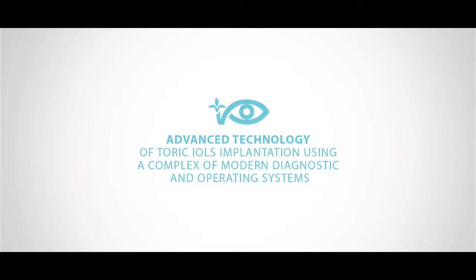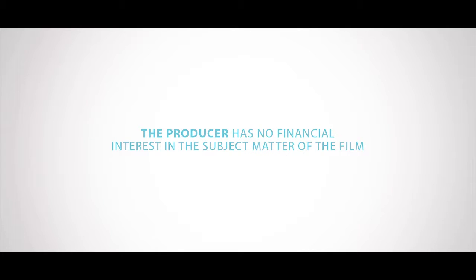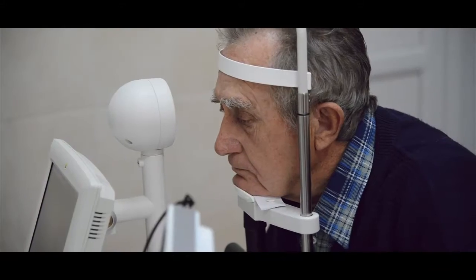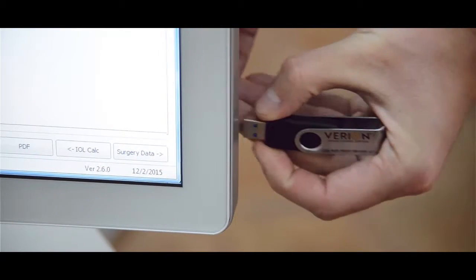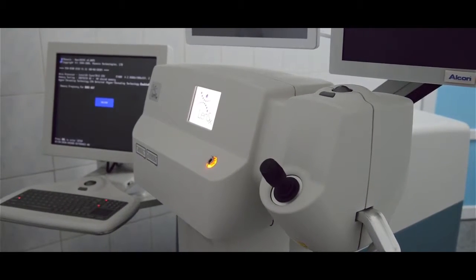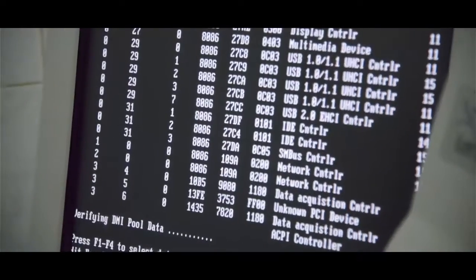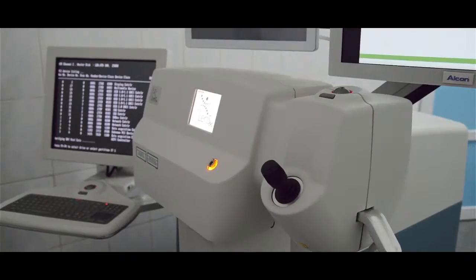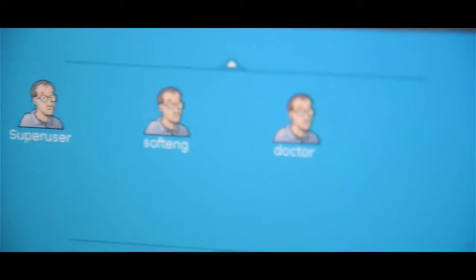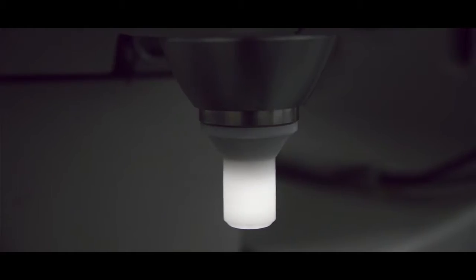Advanced technology of toric IOL implantation using a complex of modern diagnostic and operating systems. Modern approaches to cataract surgery are based on the capability of standardizing each surgical step using computer technology. Such units as an integrated anterior segment optical coherence tomograph, video microscope, and femtosecond laser are applied in the LenSx laser in order to carry out image-guided cataract surgery.